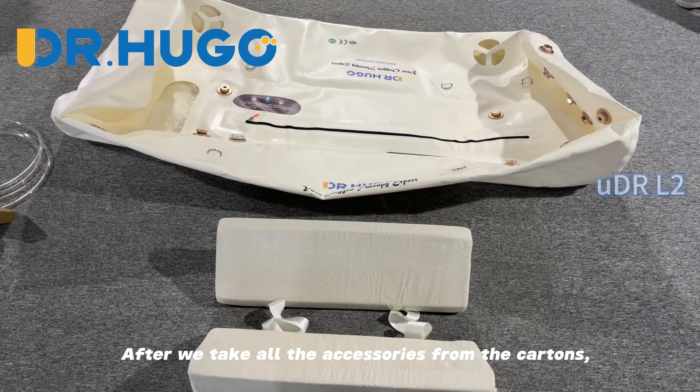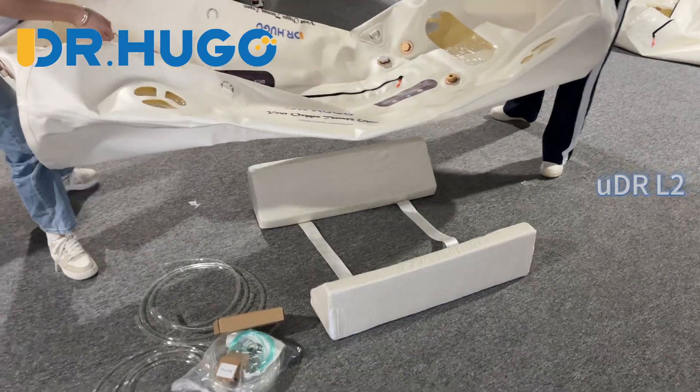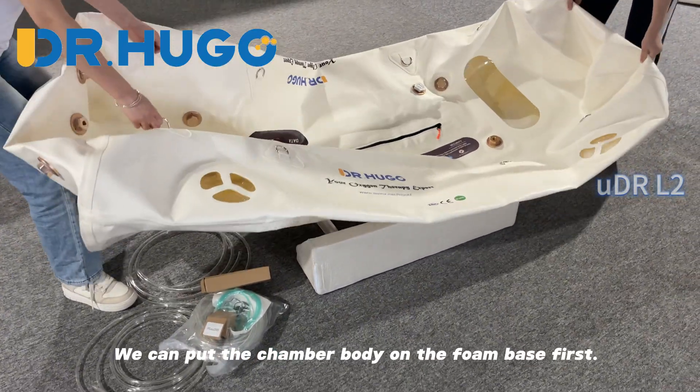After we took all the accessories from the cartons, we can start to assemble the hyperbaric chamber. We can put the chamber body on the foam base first.